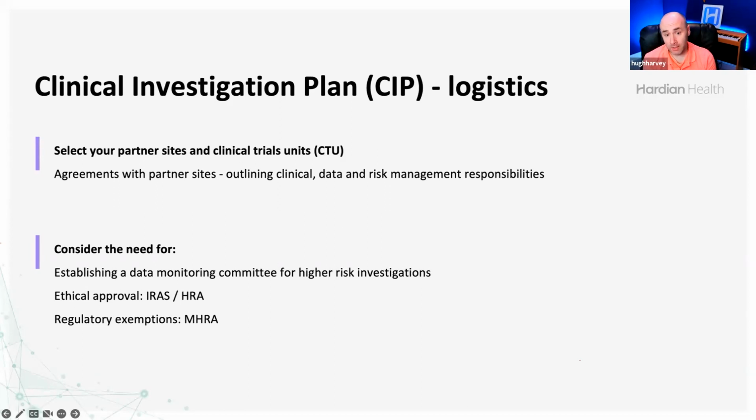For higher risk investigations, it's common good practice to establish a data monitoring committee. So if you are collecting real world data on real patients, whether it's anonymized or not, it's important to consider whether you need a data monitoring committee. And if you are collecting real world data on real patients and you are intending to affect real world patient care through any mechanism of intervention, you will likely need ethical approval.